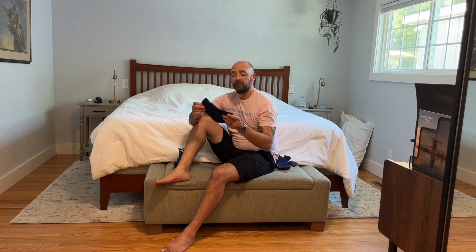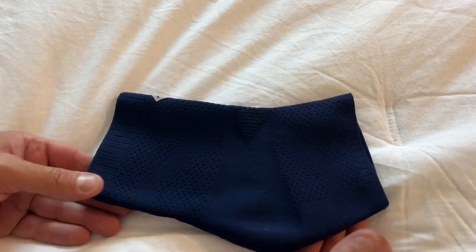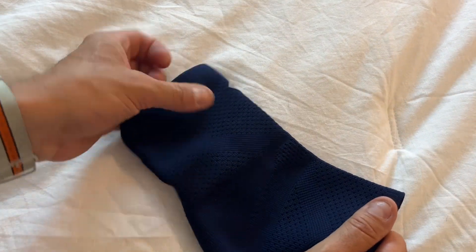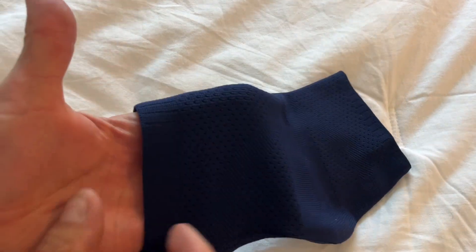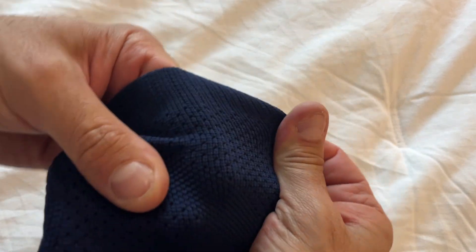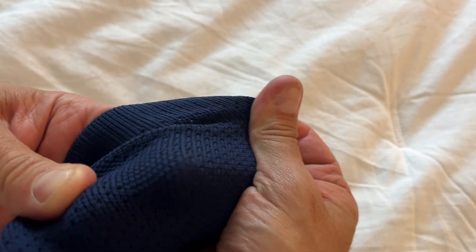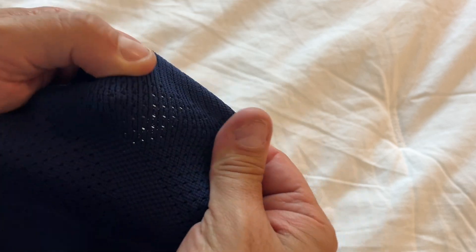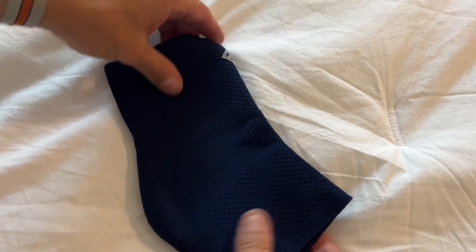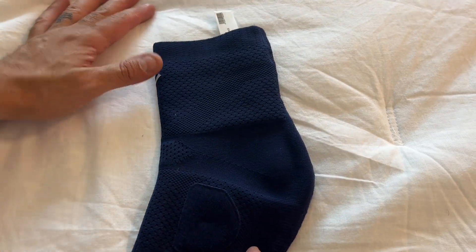So next, let's take a look at the wrap up close and show you all the details. Here is our sleeve up close. What I like about it is how stretchy it is, and also just how breathable that material is. As you stretch this out, you can really see the fine micro holes that allow the air to pass through, which is great because you do need a little bit of air breathing through.